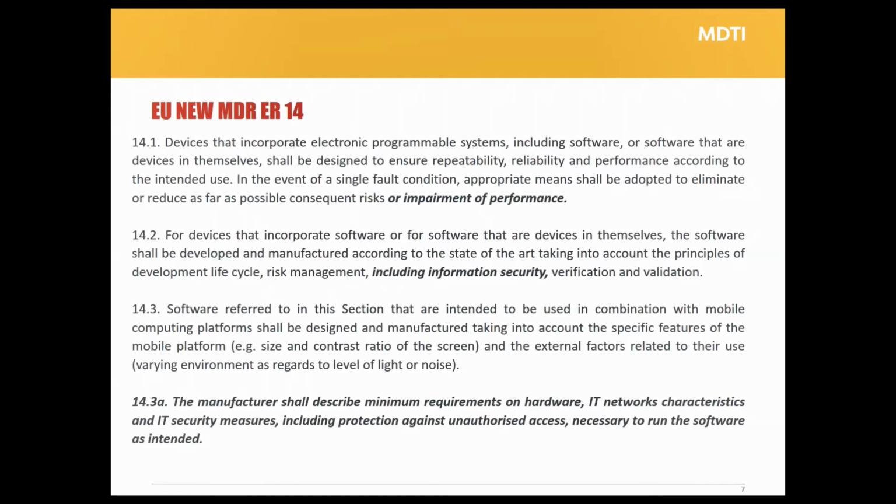We're not going to specifically dwell on it, but for those of you who want to look at IEC 62366, it defines some of the requirements there. Usability is an overarching thing in the new regulation, so don't let that one go away from you.